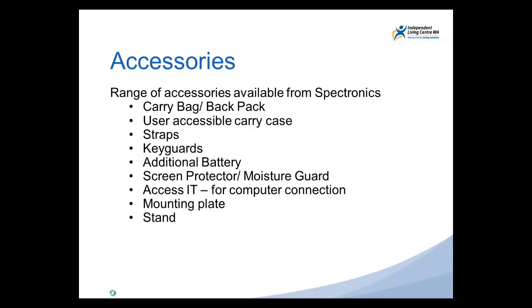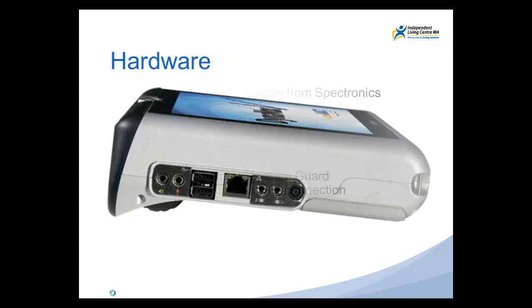Just briefly, there are a range of accessories available, from carry bags to key guards and straps to increase accessibility, as well as different resources such as the Access IT to be able to connect to your computer, and stands and mounting plates to make the device be positioned in the best position for the individual.